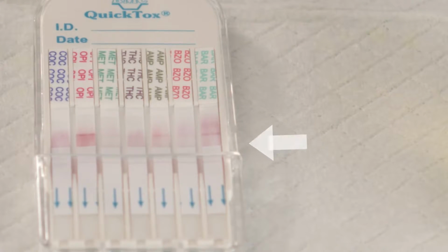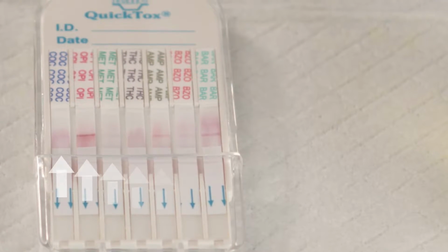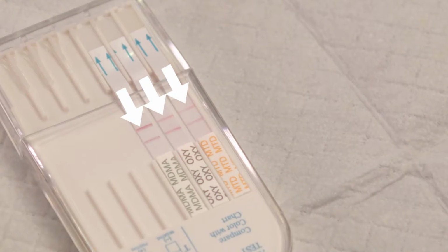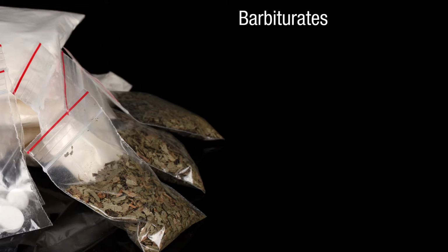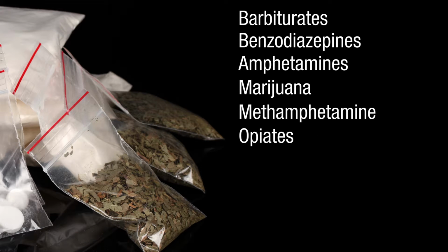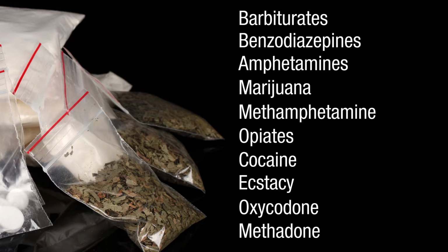Once the control band, C, appears in 5 minutes or less, results are ready to interpret. Look at each test strip separately. Read the results on one side, then turn the device over and read results on the other side. The 10-panel Quick Tox dip card tests for these substances: barbiturates, benzodiazepines, amphetamines, marijuana or THC, methamphetamine, opiates at 2,000 nanograms per milliliter, cocaine, ecstasy or MDMA, oxycodone, methadone.